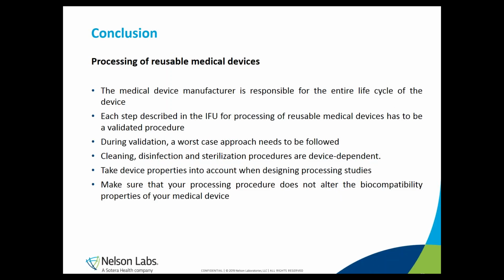Be aware that as a medical device manufacturer, according to the new MDR, you will be the one that will be held responsible for the entire life cycle of a medical device. So this means from the first use of the device over the entire life cycle, including all processing and until the end of life of your device. Be also aware that each step that is written in the instruction for use manual provided with your reusable device regarding processing of the device has to be validated in advance.